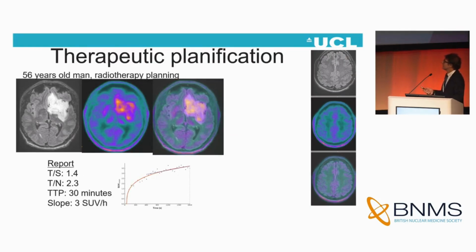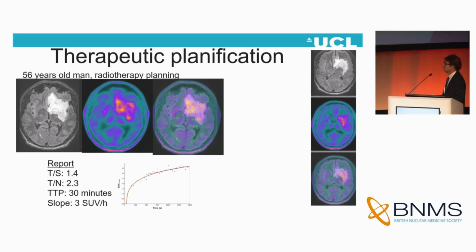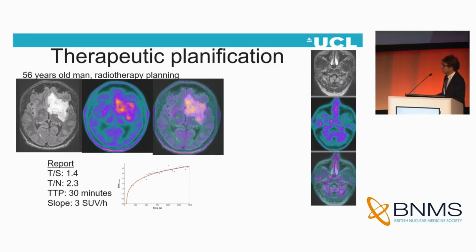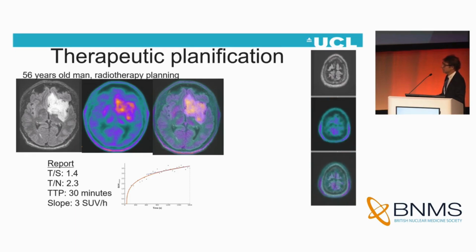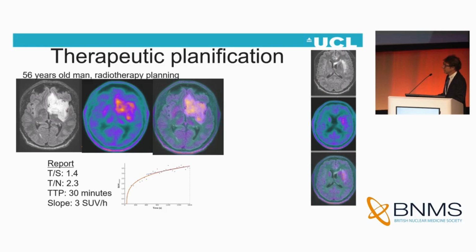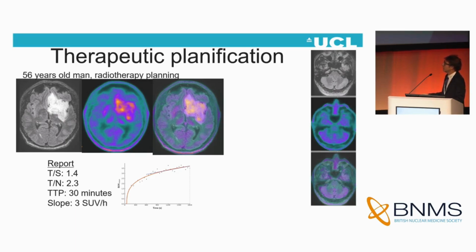It's important to understand before treatment how to possibly treat this patient, so as to have a clear plan. Here is an ambiguous case because, as you see, the tumor to background and the tumor to striatum are quite high. However, the type of curve is more in keeping with a benign lesion. It's definitely quite aggressive in terms of infiltration of the brain.